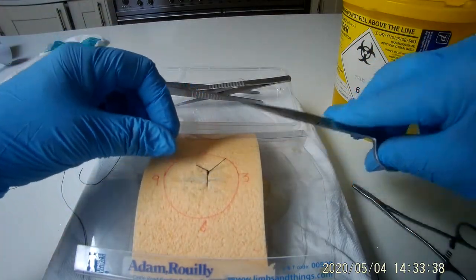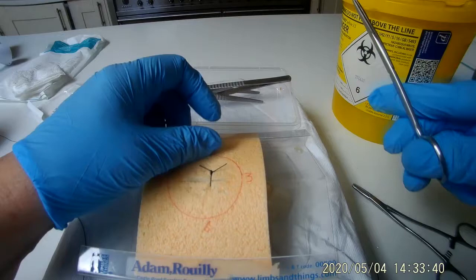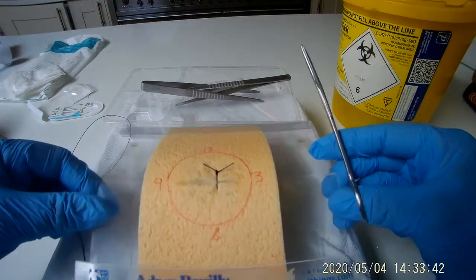Well done, you have just completed your first interrupted suture using a surgeon's knot.